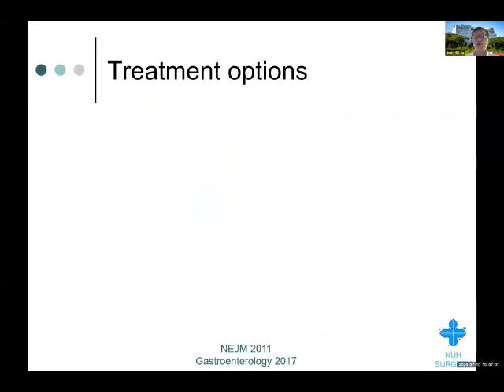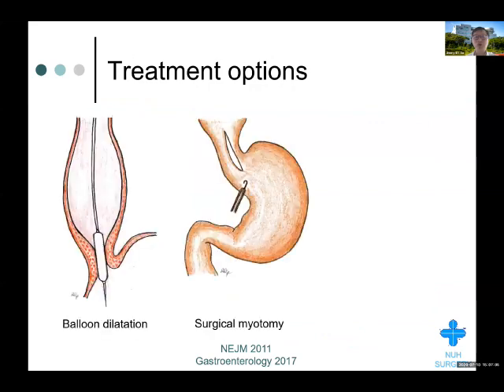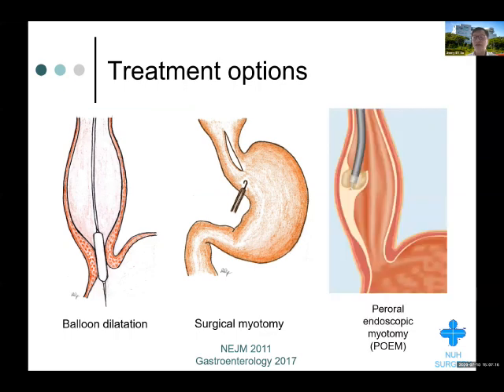These are the treatment options. Conventionally, the two standard treatment options for achalasia are balloon dilatation and surgical myotomy. But certainly in the last decade, most attention has gone to what we call peroral endoscopic myotomy, or POEM.